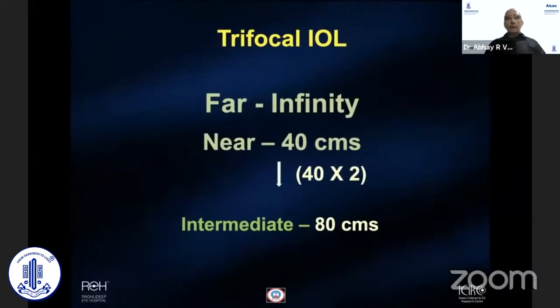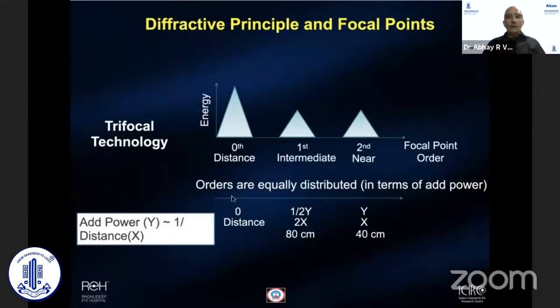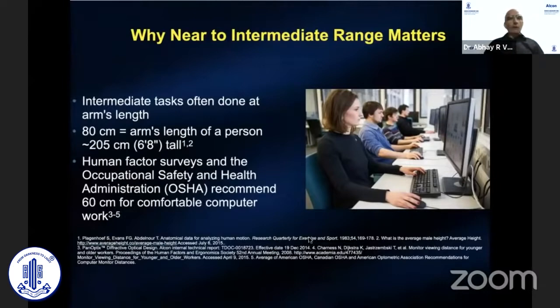So typically the trifocal from infinity or distance was fixed to 40 centimeters, and then the second order was added, like a base of the pizza, and they were attached there. Then with the phasing of the optical principle, the intermediate distance has to be 80 centimeters. This slide explains what it means. With the distance correction and 40 centimeters as a good near distance, one has to have half of that diopter, and a wider distance between the rings, giving an intermediate. Because of the wavefront and the phasing of the optical light, it has to be at 80 centimeters. So the intermediate distance became 80 centimeters, and it worked quite well until we went again and researched it.